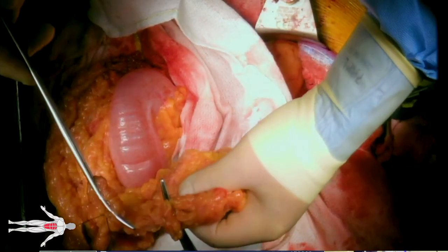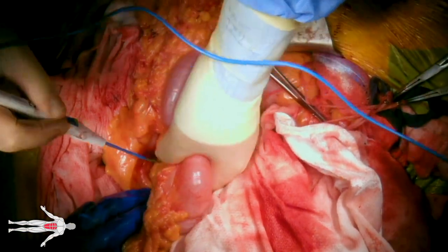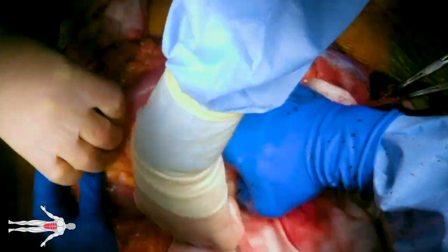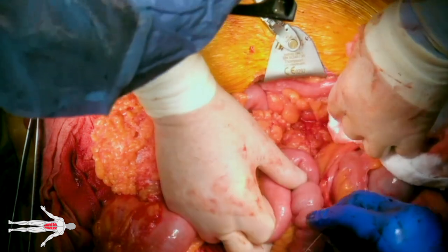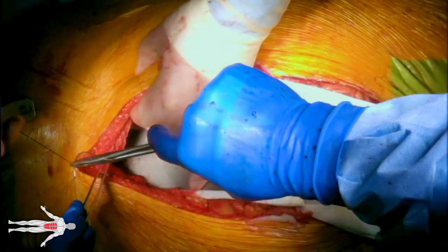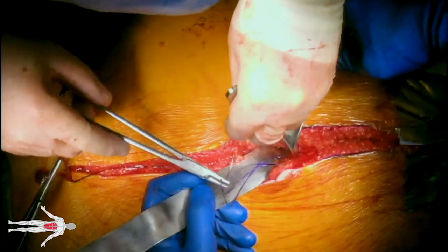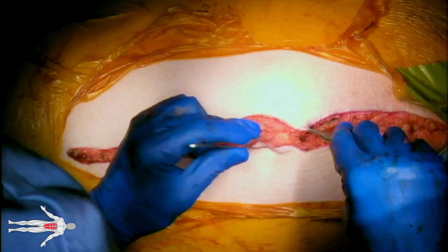At this time, an omental flap of adequate length is created ensuring adequate blood supply, and then passed through a tunnel in the transverse colon mesentery. The flap is then secured to the retroperitoneum using 3-0 PDS suture. The abdomen is then closed with a number one loop PDS suture and the skin is re-approximated using staples.